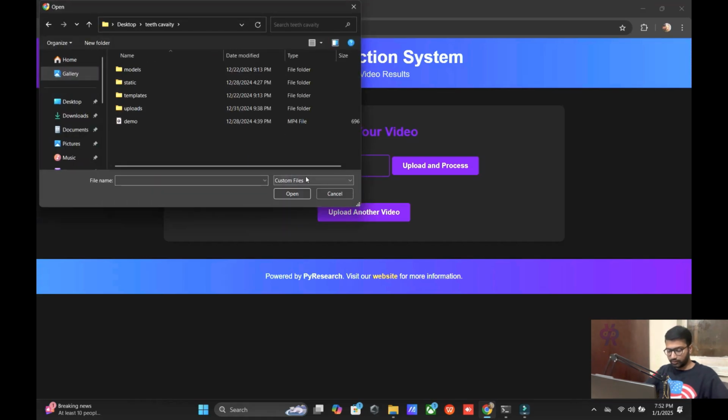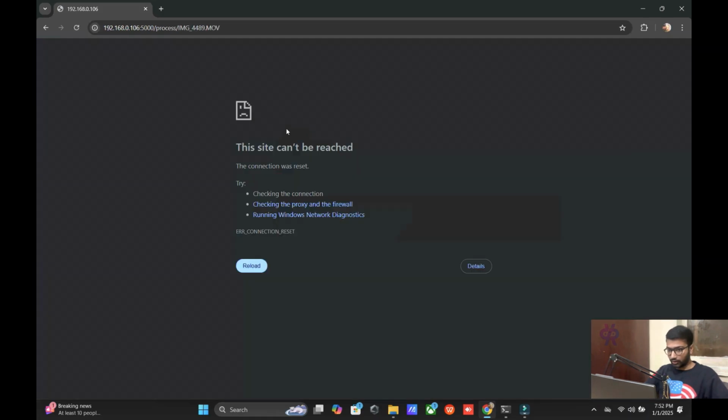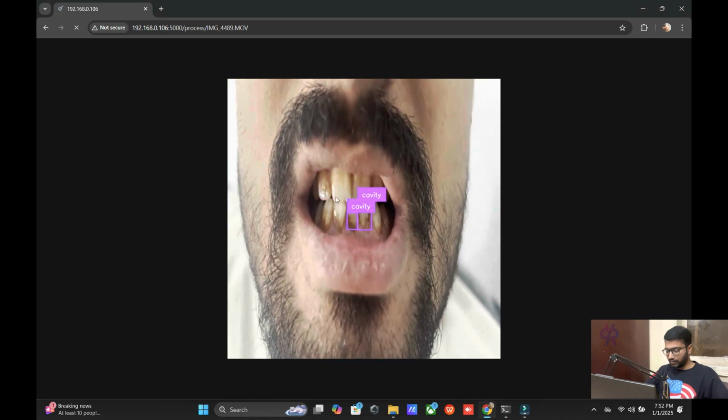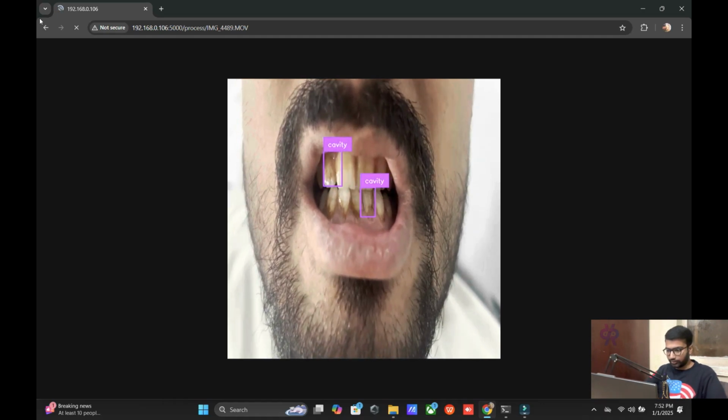Just like I have three categories of demo, and here it's real time. I am recording my mouth and it will be real time. Okay, it's cavity detection. It checks whether cavity on the teeth side is available or not. So it's a very simple process. Let me check what happened. Yeah, this one is a cavity here, here and here. So it's cavity detection. And let me check another process.